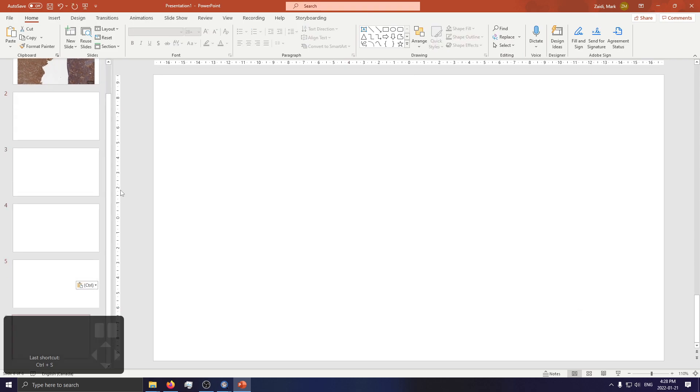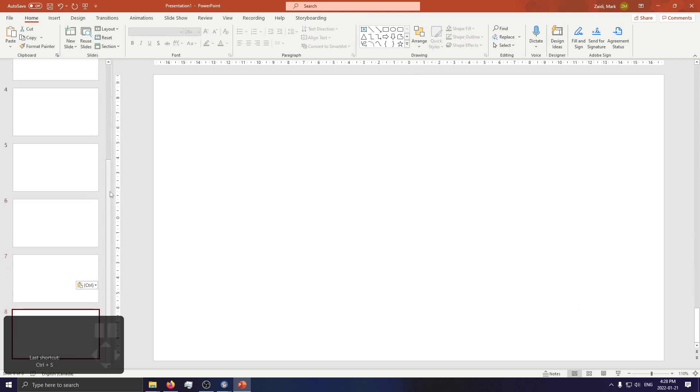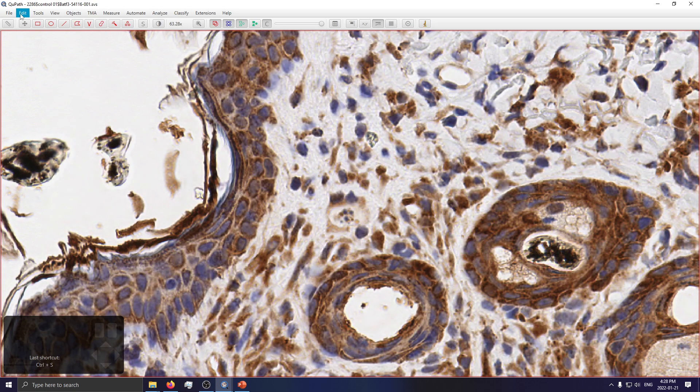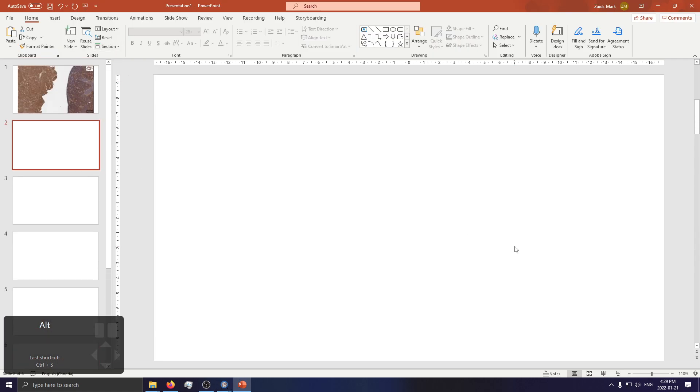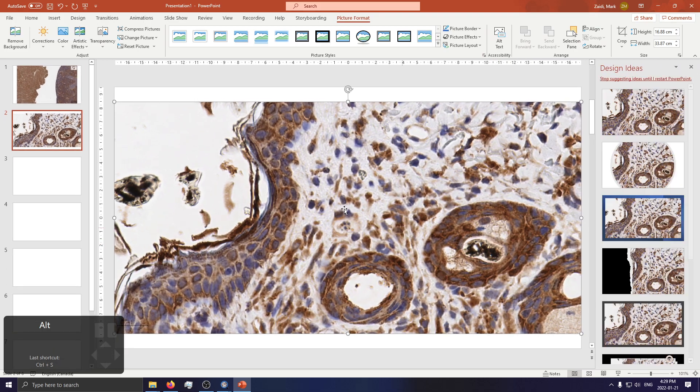Same as before — Copy to Clipboard, Current Viewer. You used to be able to do Ctrl+C and Ctrl+V, but Ctrl+C was temporarily disabled in this current version — no problem, it's just one extra click. Let's copy it again to clipboard and paste. Now we have a nice clean figure.